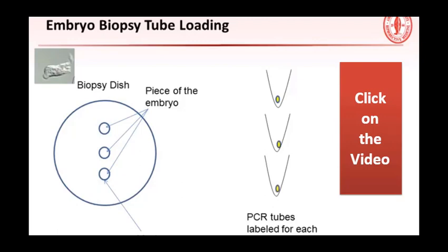Since the microcentrifuge tube is already loaded with media, extreme care should be taken to minimize the amount of media carried over during the loading procedure. One of the problems with loading is that it can be difficult to see the biopsied material being expelled into the tube under the microscope.